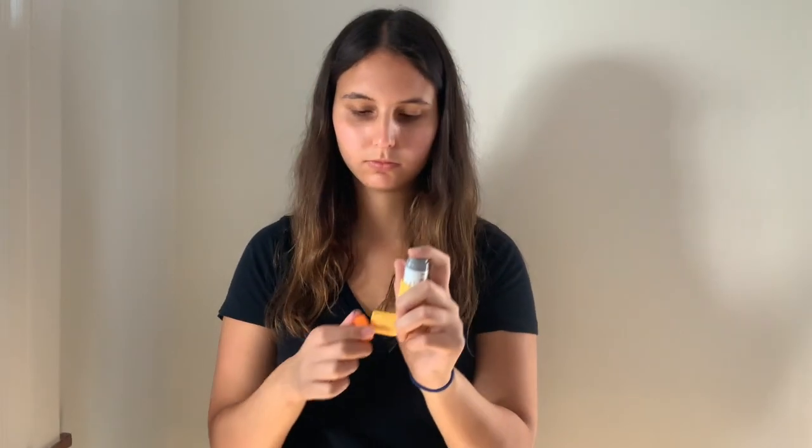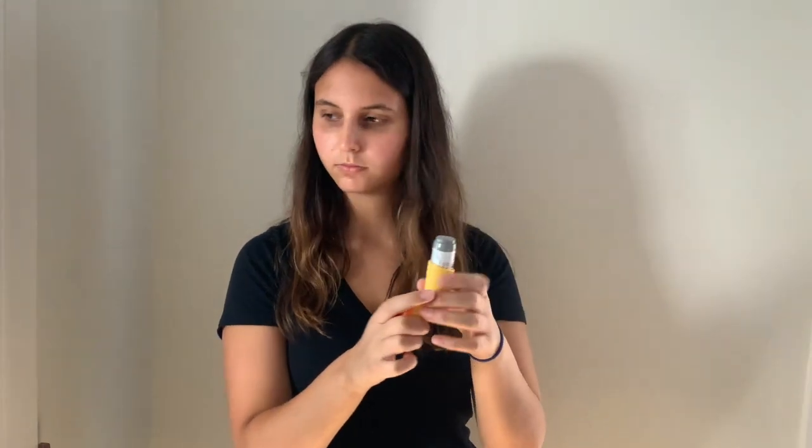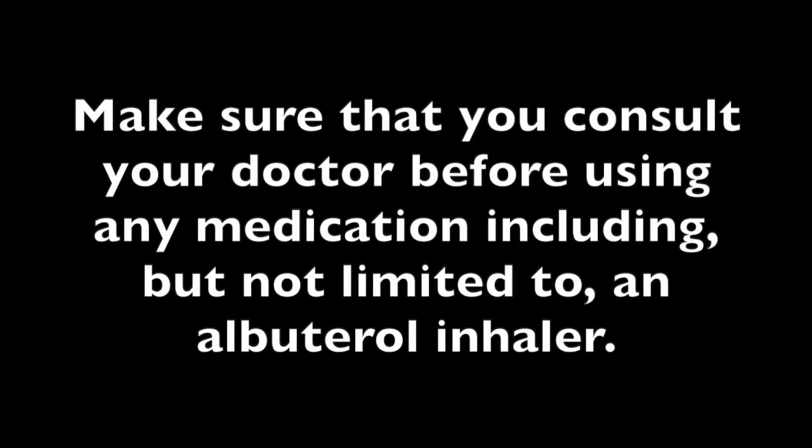After using the medication, you then want to disconnect your inhaler from the spacer and put the cap on it and store it safely. Only use this medication if prescribed and directed by your doctor or healthcare professional.